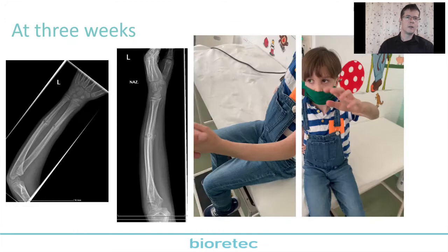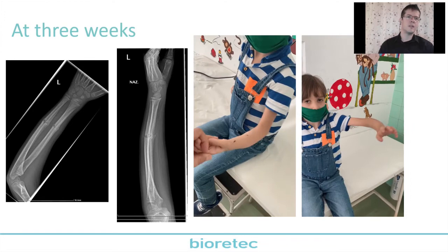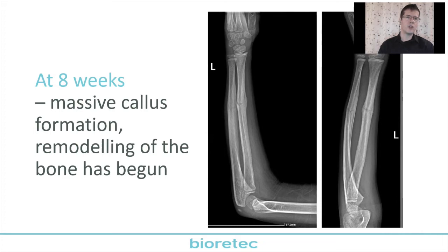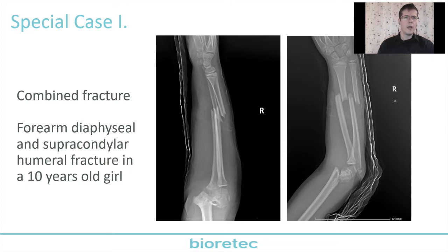And here we can see his function after 3 weeks. We can see even callus formation, no restriction. Of course, we gave him a short cast after 3 weeks. And next slide, please. And we can see his picture after 8 weeks. I think it is a very impressive bone healing. The fracture line is still visible, but it seems very stable, so no need for any further immobilization, no need for further cast.